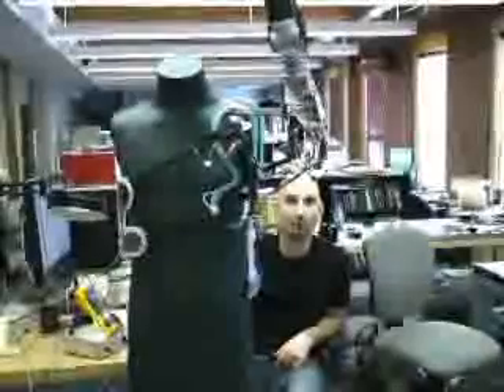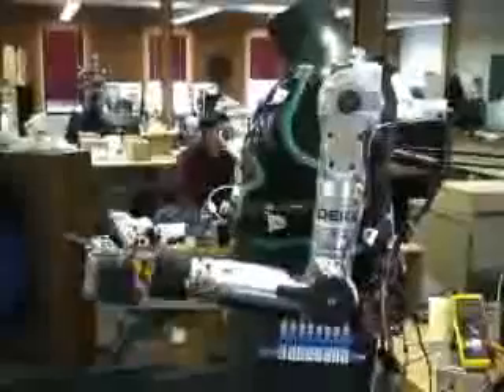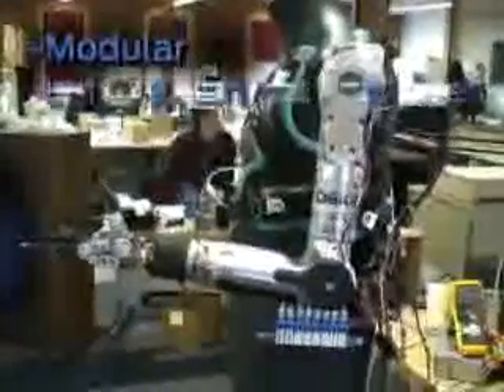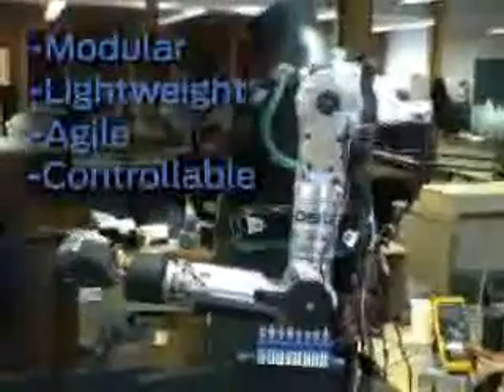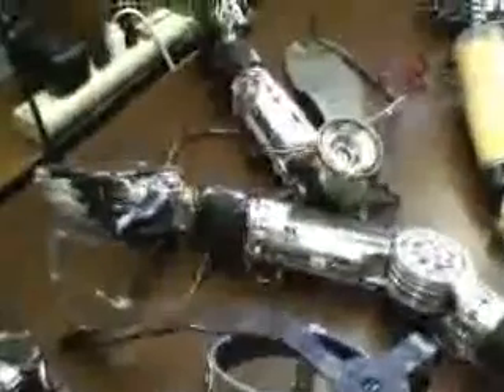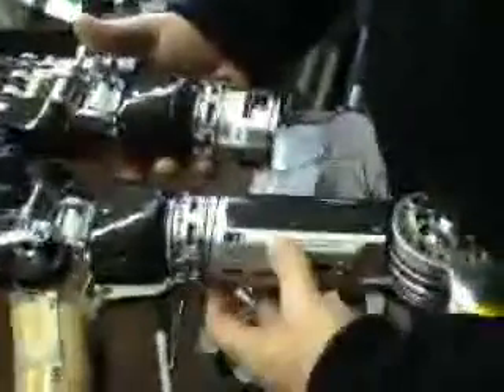Kamen's team decided that the arm needed four main characteristics: it had to be modular, lightweight, agile, and it had to support customizable controls. The arm is modular, so they can take pieces of it to fit all three levels of upper-limb amputation. DECA engineers built the arm in independent sections so it could be customized for any amputee — from the hand, they can add a forearm, an elbow, and even a shoulder socket.